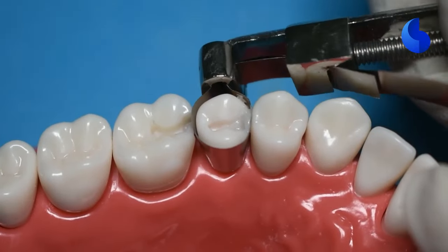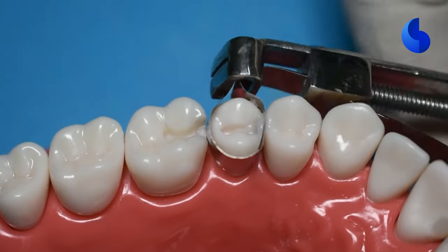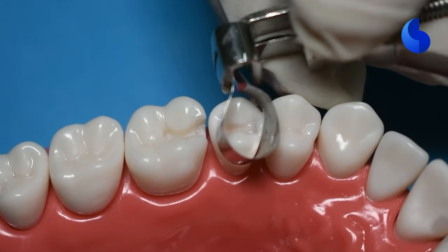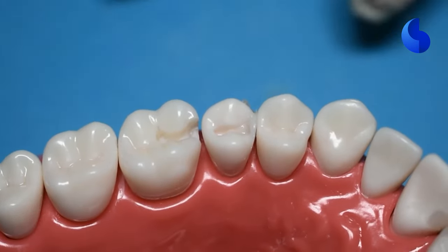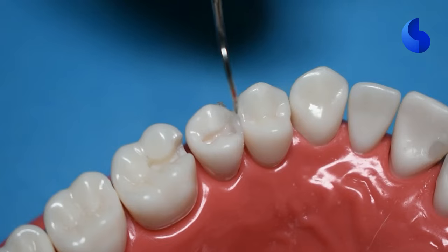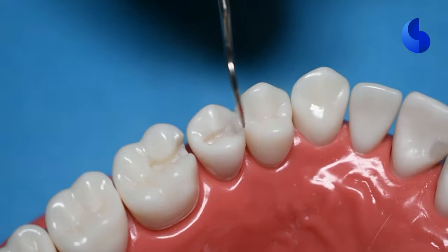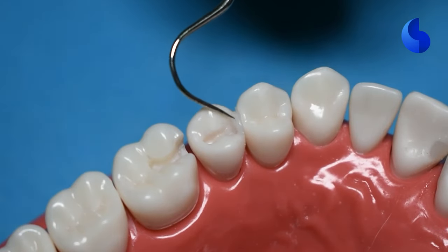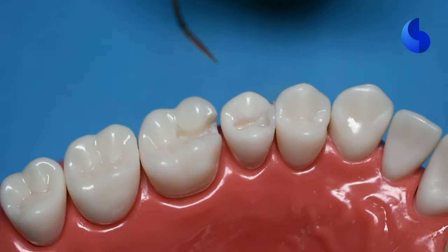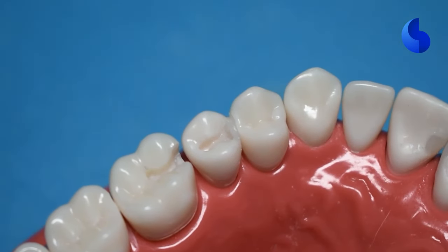Because it's cured, this is not an amalgam restoration. You don't really have to fear breaking the wall off. So slowly slide it out. There you have it. The marginal ridge is a little high, but we can always adjust it and polish it. Take an explorer and just knock off all the excess material that's still sticking onto the tooth. Ensure that this is completely cured. And then you're ready for your next step of adding some more composite material into this cavity.